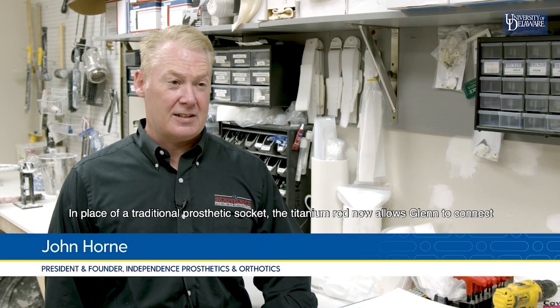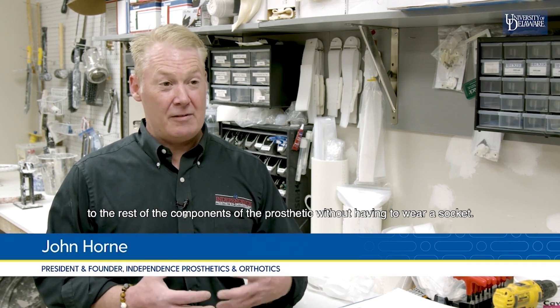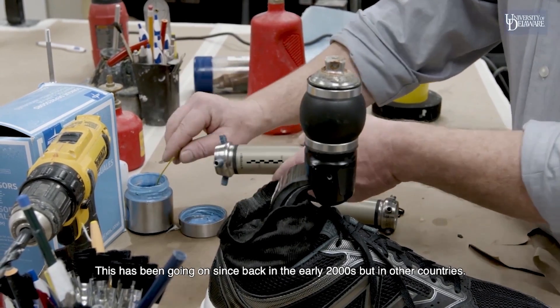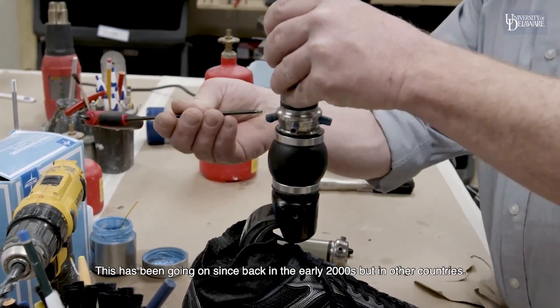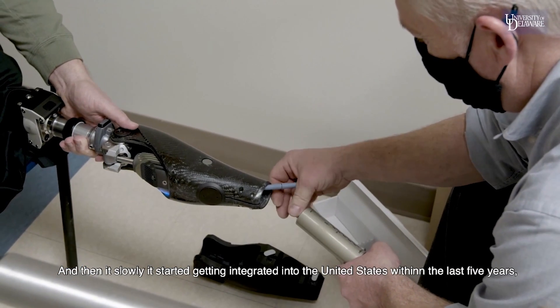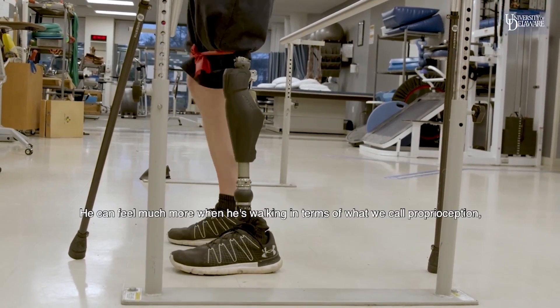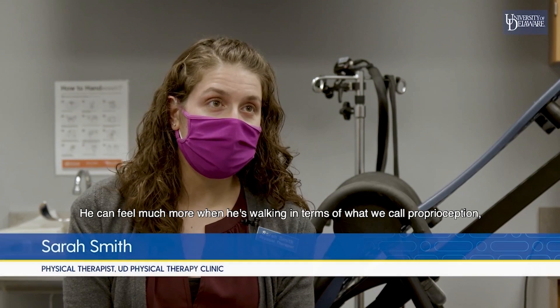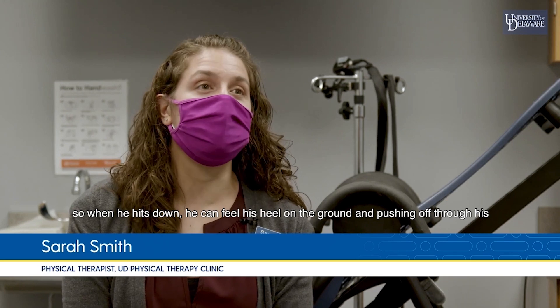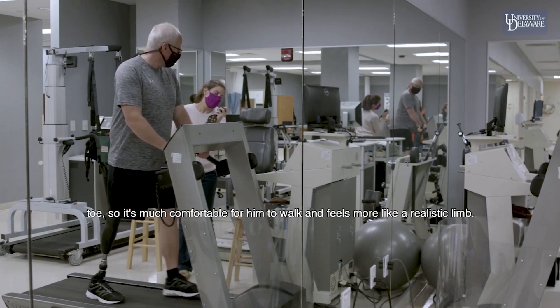In place of a traditional prosthetic socket, the titanium rod now allows Glenn to connect to the rest of the prosthetic components without wearing a socket. Glenn is probably one of the first 100 people in the country to have this. It's been available in other countries since the early 2000s, slowly integrating into the United States within the last five years, starting with military personnel and now extending to the civilian population. He can feel much more when walking — what we call proprioception — feeling his heel on the ground and pushing off through his toe, making it much more comfortable and realistic.